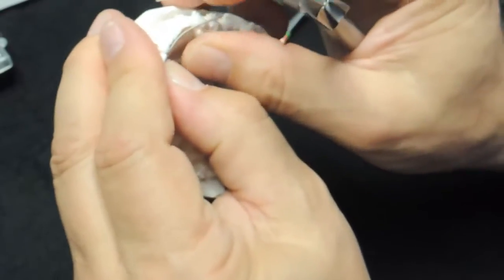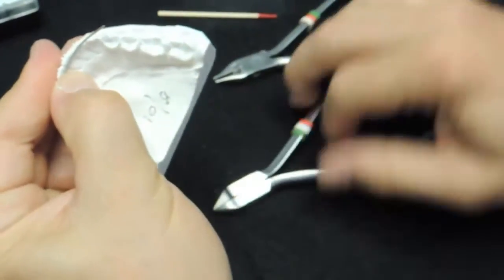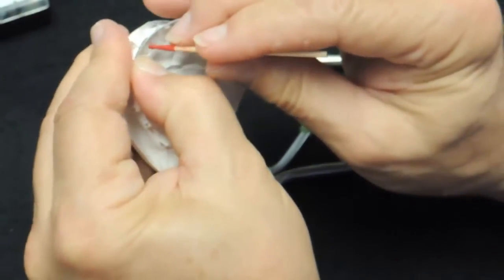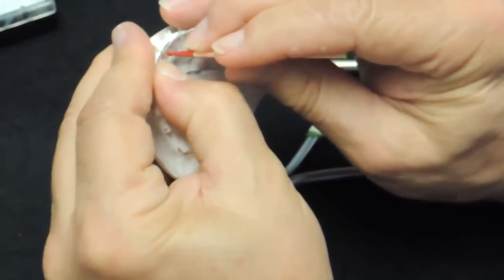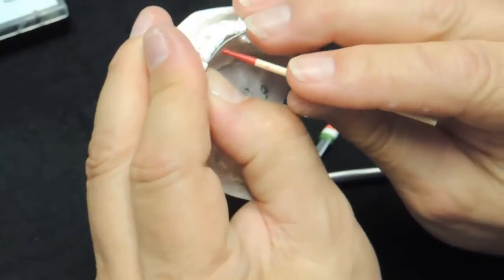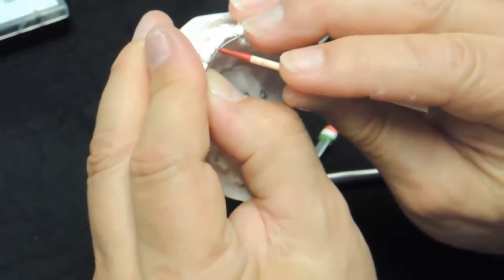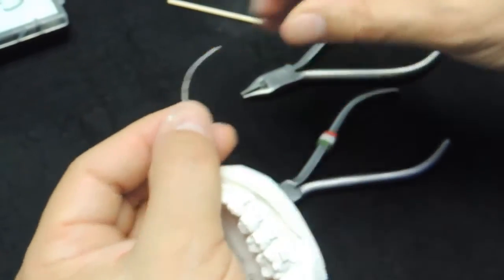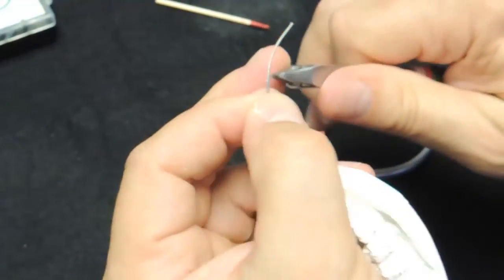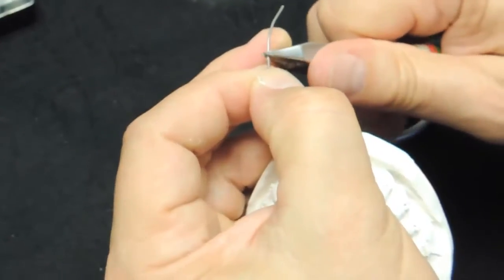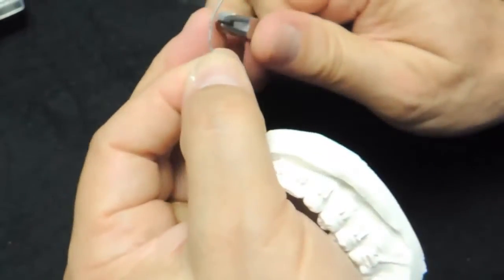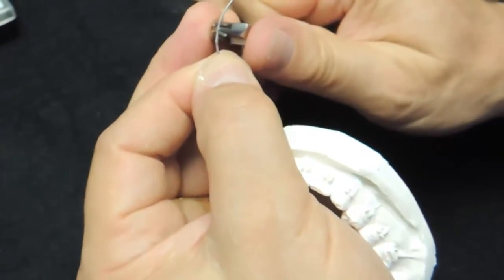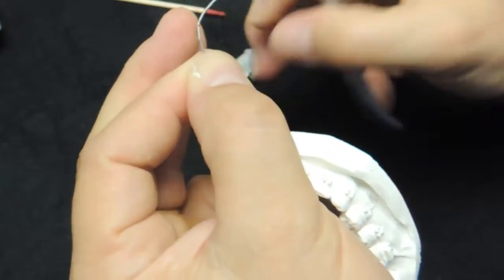And I'll hold that where I have it, and the next point looks like I need to make a small adjustment here. My other little bayonet bend will be over here at this lateral, so I'll mark that ahead of time. I'll bend this wire down a little here, put another offset here between the lateral and the central.